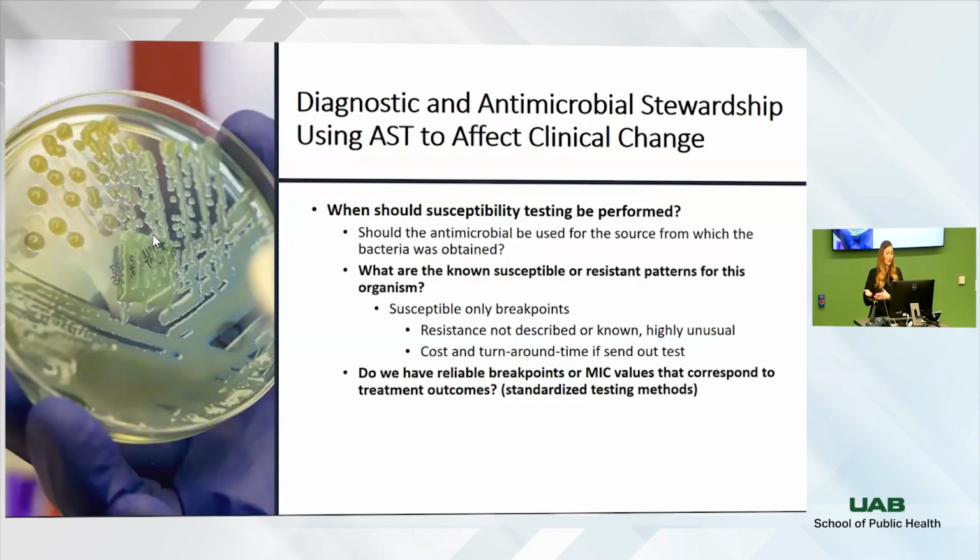So we want to say, should the antimicrobial testing even be performed? Should we be doing this for this bug drug combo? Should the antimicrobial be used from the source? Do you want to pay for an antimicrobial that should be used for a urinary tract infection if you have a leg wound? No. You want to only get results for the drug that's going to work against your UTI. Or for your leg wound, you don't care about the results for another drug that's going to work if it's a UTI. So we look at a lot of things like that.